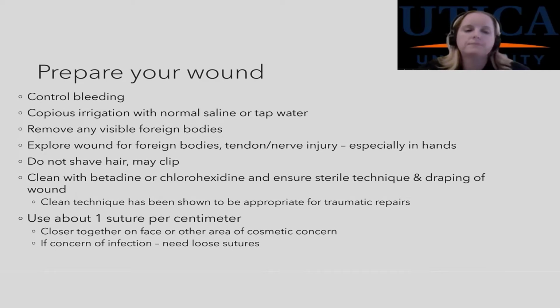That's the difference. So how many sutures do you need to put in? About 1 suture per centimeter. That is about the estimate. It's an estimate, so you kind of have to gauge as the wound is coming together and looking at it. That's why this is like an art. You're going to be kind of closer together on the face and other areas of cosmetic concern.